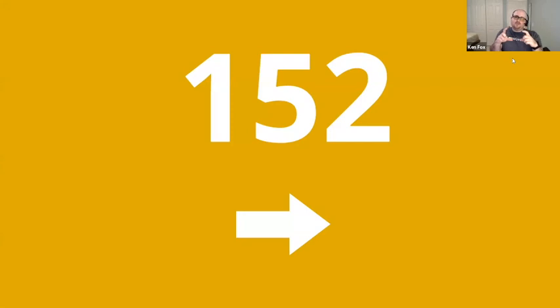I have an old Android phone that I stuck to the wall, but then now I changed it. I use one of those pop sockets and like a pop socket holder that sticks on the wall. And I put it on the phone, and I put it on the wall, and the only thing that phone does is it just shows Nightscout. And I used to have it just show this clock. Just so it's in the kitchen where my wife can see it, or I can see it over cooking dinner. I don't have to worry about looking down at our watch or whatever. You can just look up and see it. Or if someone's over taking care of the kids, they can just kind of glance over and see it as well. So kind of fun to have.